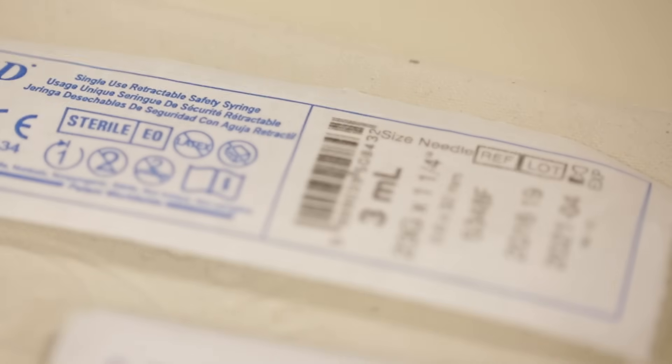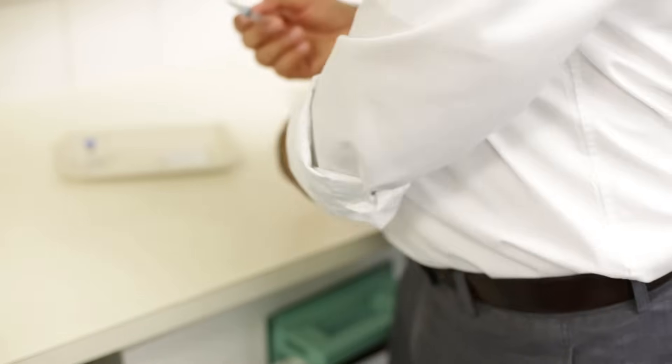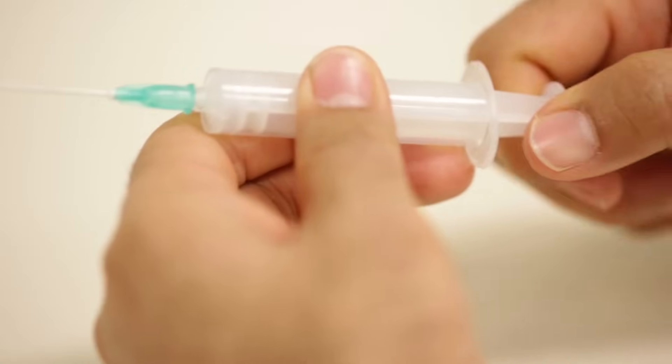For each patient, always use a syringe and needle from a new and sealed package. WHO recommends syringes that are designed not to be reused for all injections.